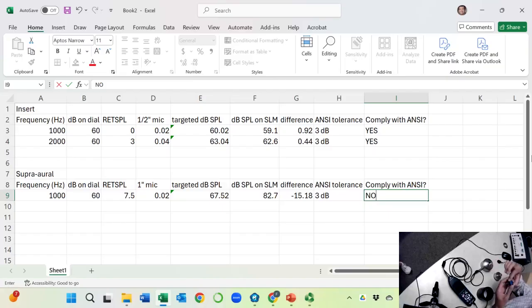So, it's correct. They made it so that the frequency response of this plastic mimics the human mastoid. Not exactly the same, but close enough. Does that make sense? So this is the artificial mastoid, a piece of plastic. Put it on the 6cc coupler.